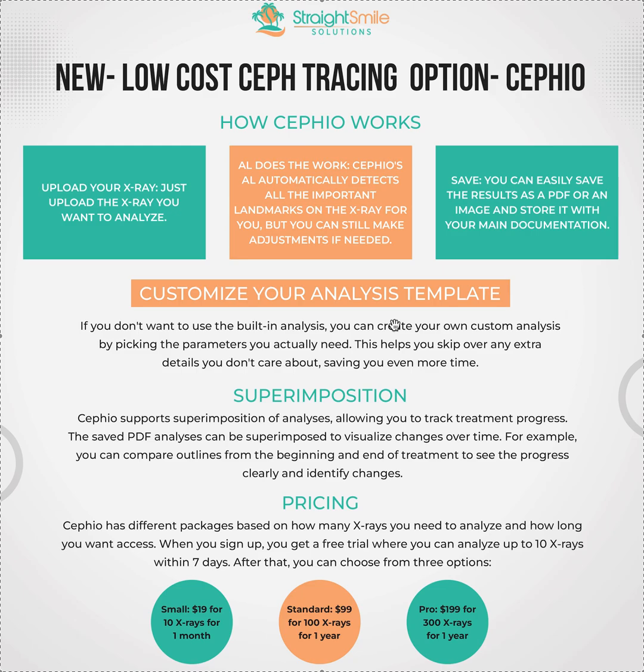and get better at orthodontics. Especially if you're doing kids, you got to do it. You got to do it if this is not a class 1 case. You got to do it. And even adults, now with CBCT and Invisalign planning in adults, it's probably not as necessary. You won't have the diagnostics though. Especially if you're trying to get insurance to approve it, at least if you can say, this is class 2 div 1, this is high angle. By having the Ceph and the Ceph numbers, you're much more likely to get your insurance covered because you're making a formal diagnosis.